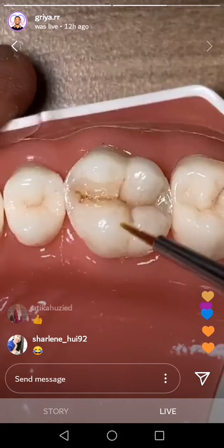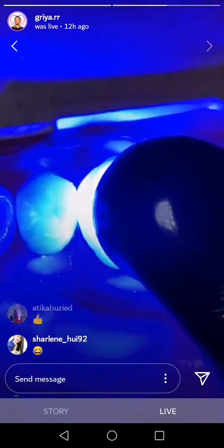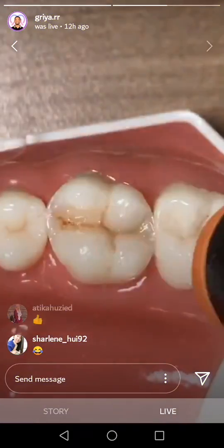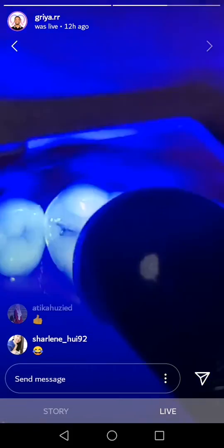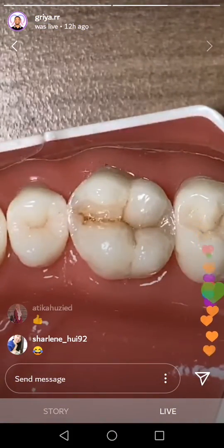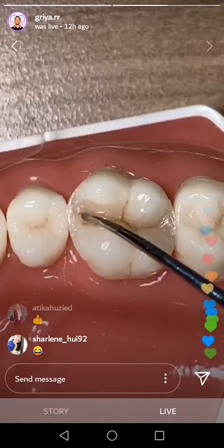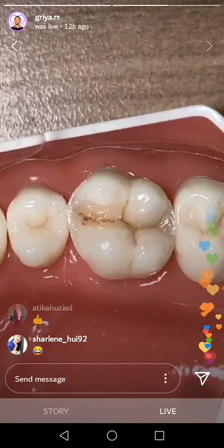Okay, let's continue. Where's my light here? Oh my god. Okay, now, sorry. Okay, now I will go to this one. Okay, this one, and then this little, and then this is the last.